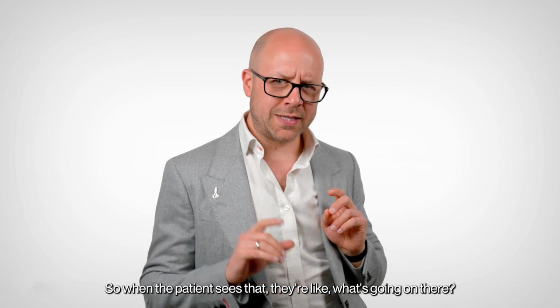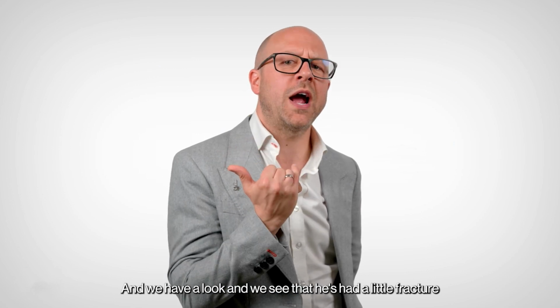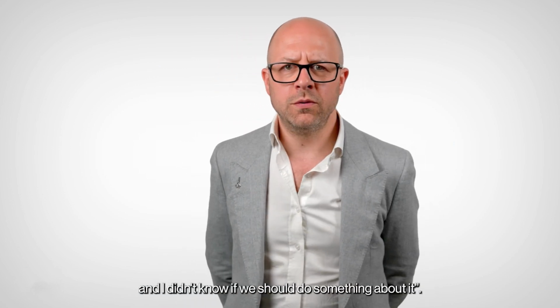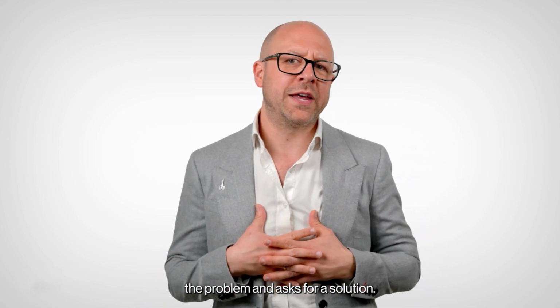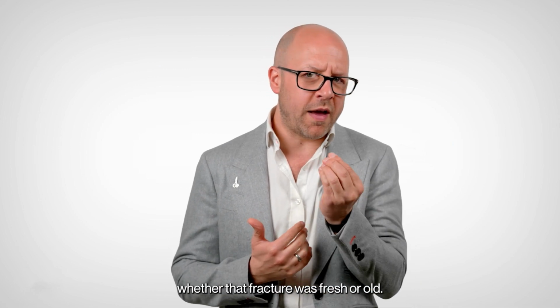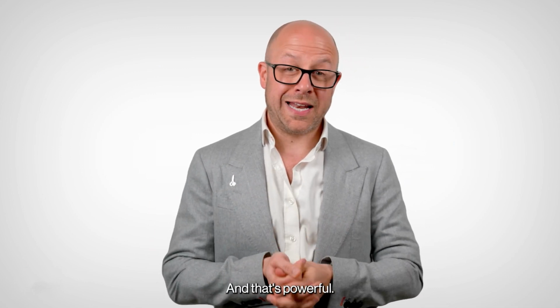So when the patient sees that, they're like, what's going on there? Why is that bit of my tooth red? And we have a look and we see that he had a little fracture on his lower incisor. He goes, yeah, I did see that. And I didn't know if we should do something about it. So in that instant, the patient sees the problem and asks for a solution. And I'm not smart enough to remember whether that fracture was fresh or old, but the scan tells me, and it shows the patient that something needs doing. And that's powerful.